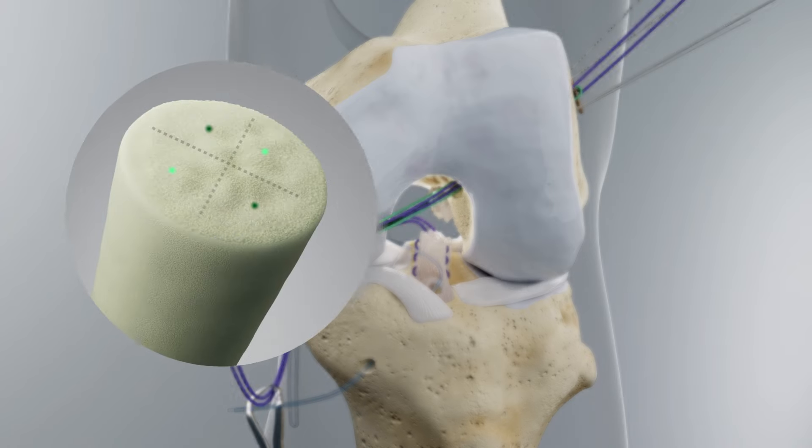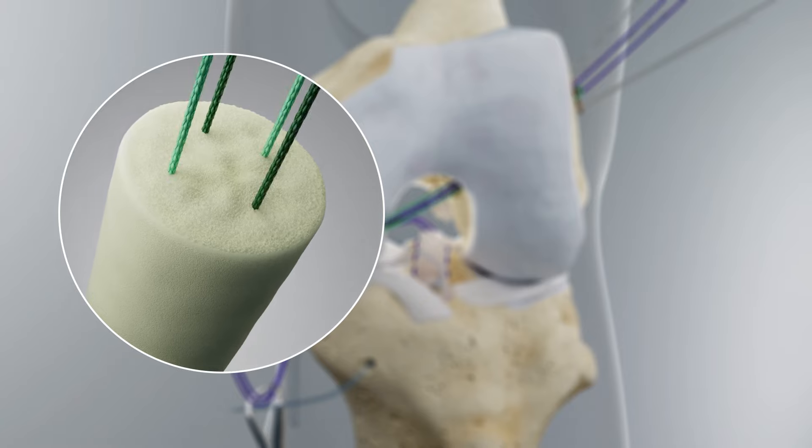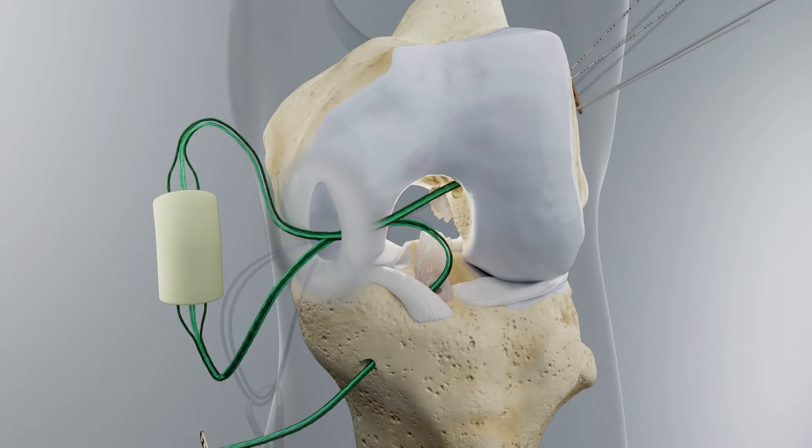Using a 2.5-inch straight Keith needle, thread one limb of the cinch suture through each quadrant of the bare implant. Sutures should be passed through the more porous end of the implant first. Pass the cinch sutures through the tibial tunnel. Load a fixation button onto the cinch sutures exiting the tibial tunnel and secure these sutures with a clamp.